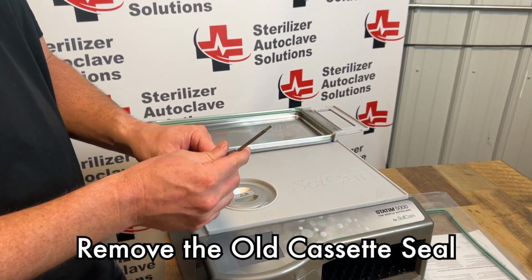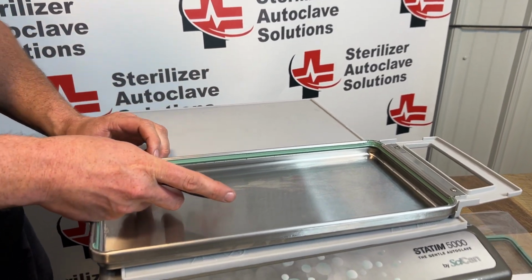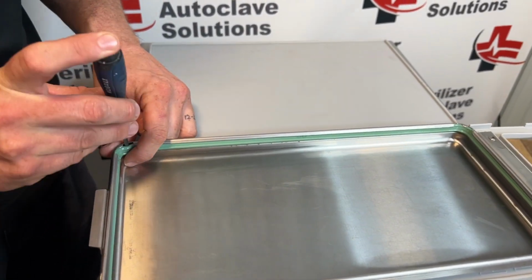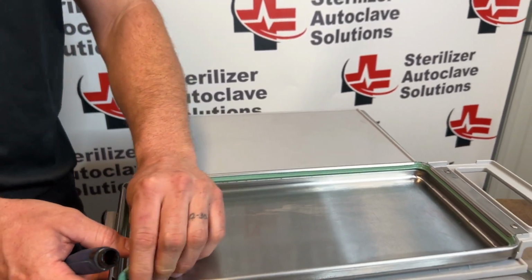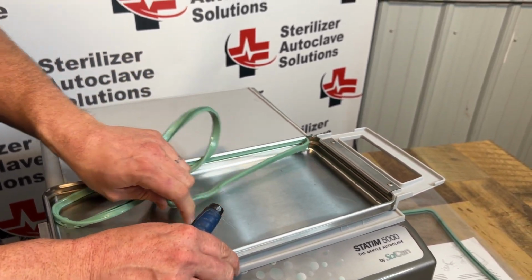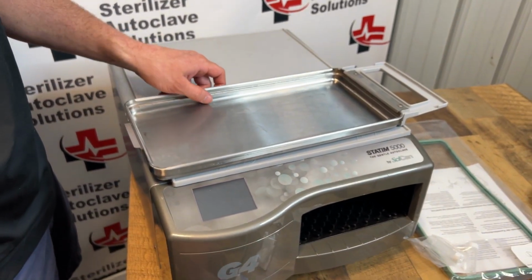Next, using a small flathead screwdriver, I'm going to remove the old seal. This is a brand new seal, so I will be reinstalling it. To take the seal out, you want to get right on the back side of that seal in one of the corners and just kind of gently work it out. That seal should pull out nice and easy. And if you are changing your seal, discard that one.